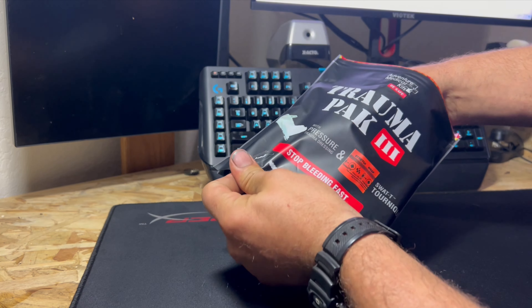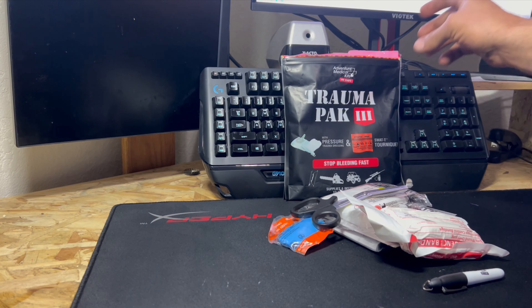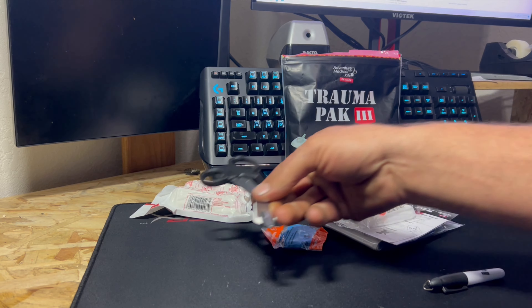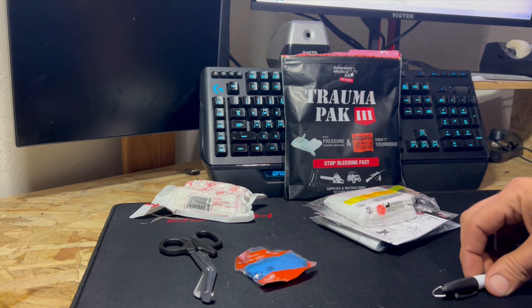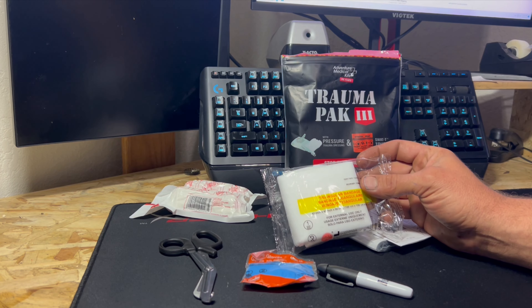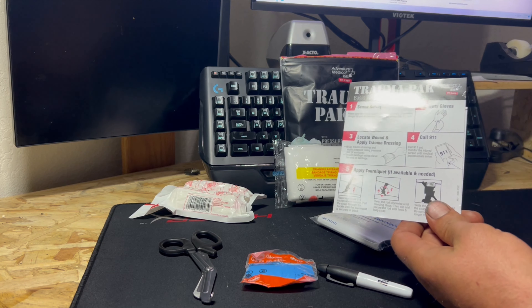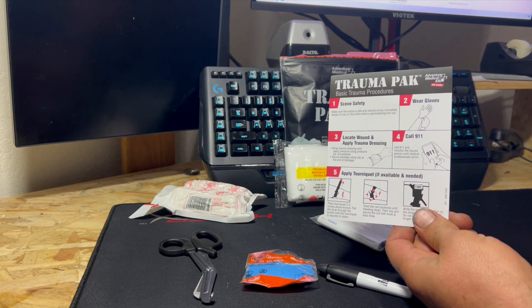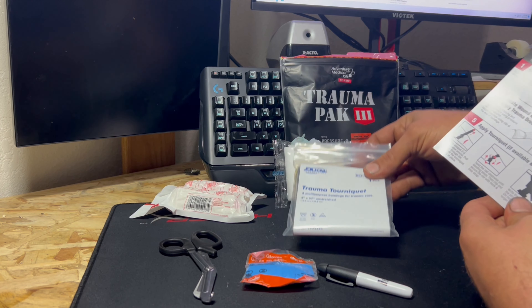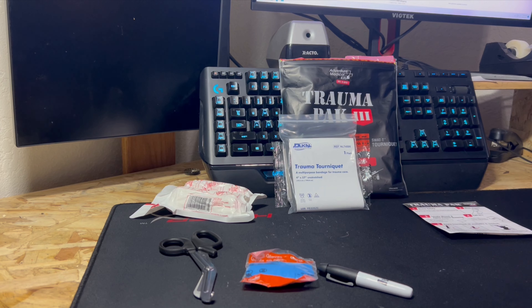Here are the contents of the Trauma Pack 3. In the kit you get a four inch compression bandage — it's a four inch Israeli bandage — a pair of EMT shears, a pair of latex-free nylon gloves, a Sharpie marker, and a triangular bandage that is 42 by 42 by 59 inches. You also get a small instruction booklet. It's funny — the booklet isn't tailored to this exact kit because it shows a CAT tourniquet, but this kit actually includes a rubber tourniquet.